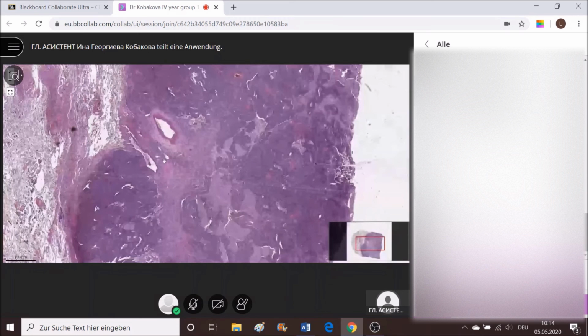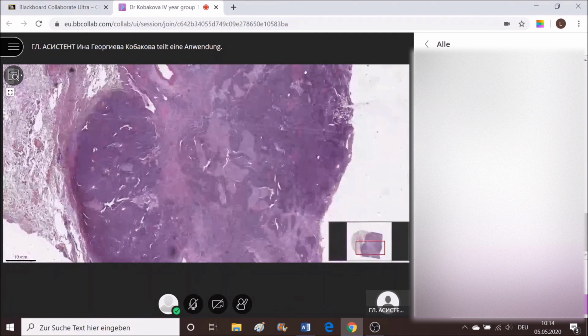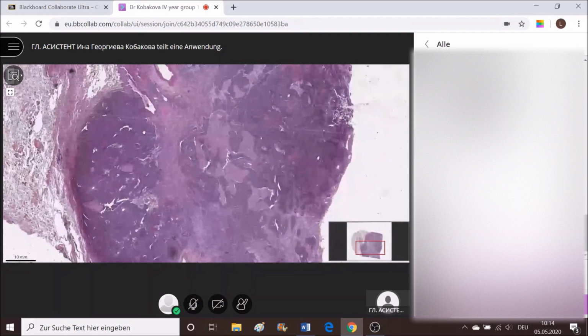Here is the tumor again. Our suggestion is malignant. Wait. Let's check out for the box. Definitely a malignant one. This one is showing many mitotic figures in here. It's not well demarcated. It's huge in size.